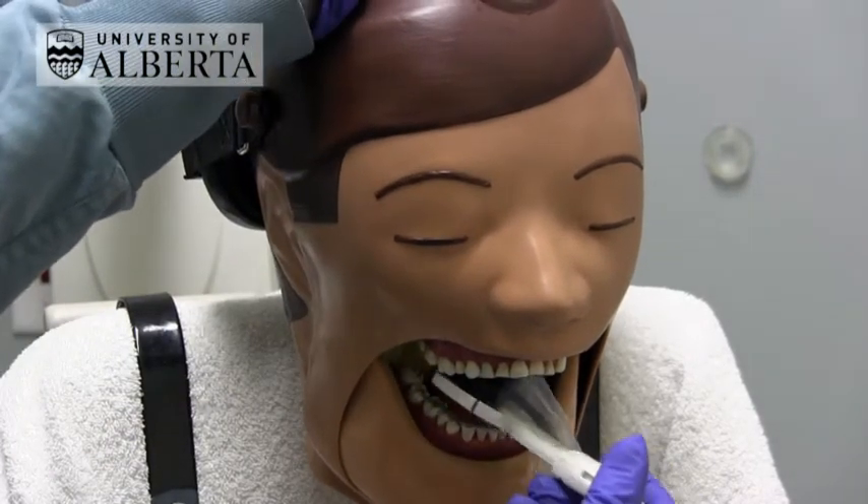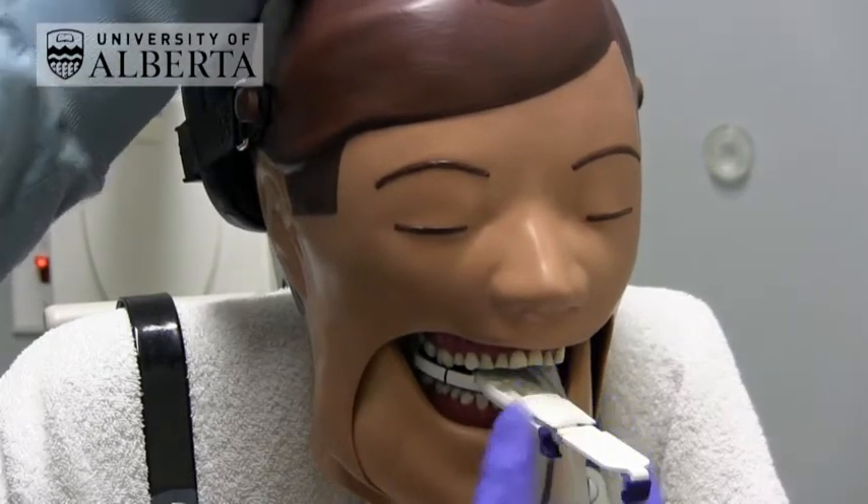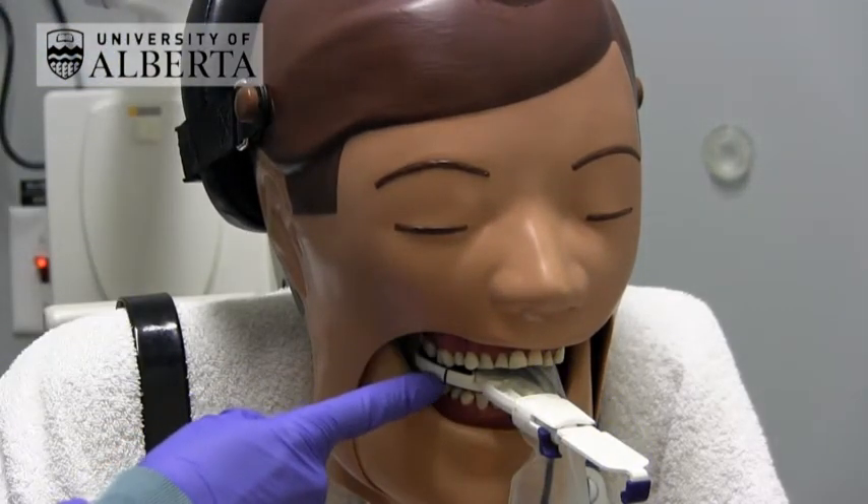Position the sensor like this and ask the patient to close together. You will notice that there is a blue line on the edge of the bite block here.